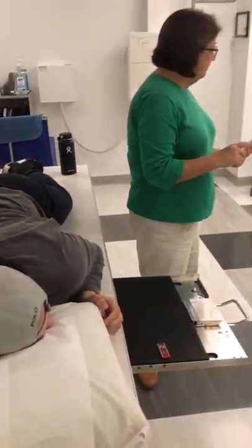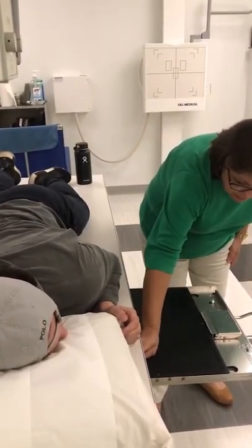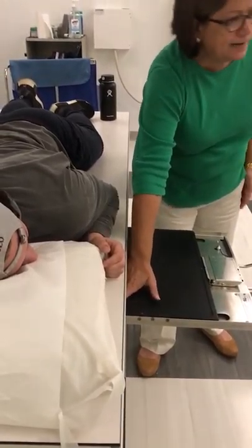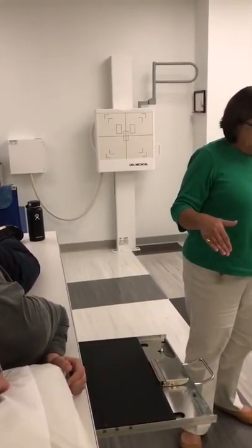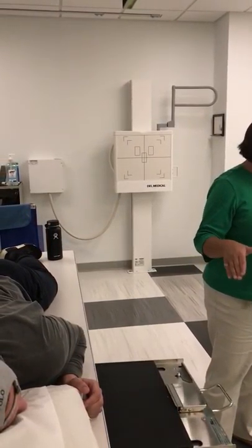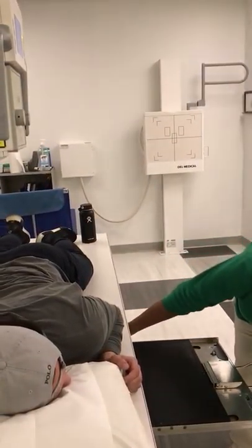So he just went from supine to prone. So his right side's over here now. So we have to switch the marker so that it's marking the right side of our patient. And we've got to check to make sure where the IR is now in relation to the top of his shoulder, because when he rolled over, maybe he changed position. And darn if he didn't.